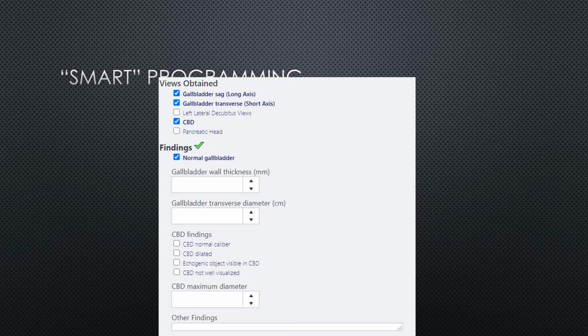And one of the recommendations that I would make is that if you want to document your exams in Meditech, it's often easiest just to, once you're done with the worksheet, and we'll talk a little bit more later about being done with the worksheet, like I said previously, you can actually lock the worksheet, so it creates just a text block that has your interpretation and findings and everything, and I would copy and paste that into the interpretation diagnostics sonography tab in Meditech.